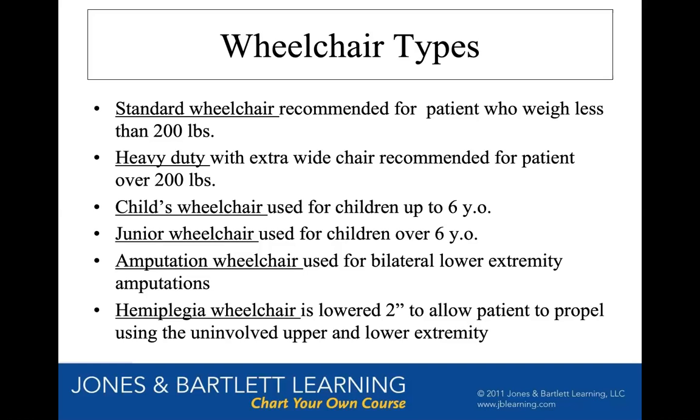And I'm talking about lower extremity amputees. And a hemiplegia wheelchair is going to be for somebody that has hemiplegia or a stroke. And what it is, it's lowered. The only difference is it's an adult sized wheelchair, but it's lowered really low to the ground. So it's kind of like a low rider wheelchair, but it's lowered so that they can still use their good arm and leg to propel the wheelchair on the floor.